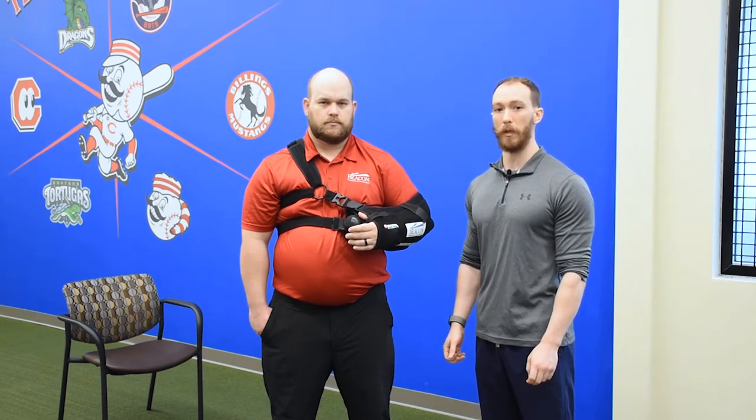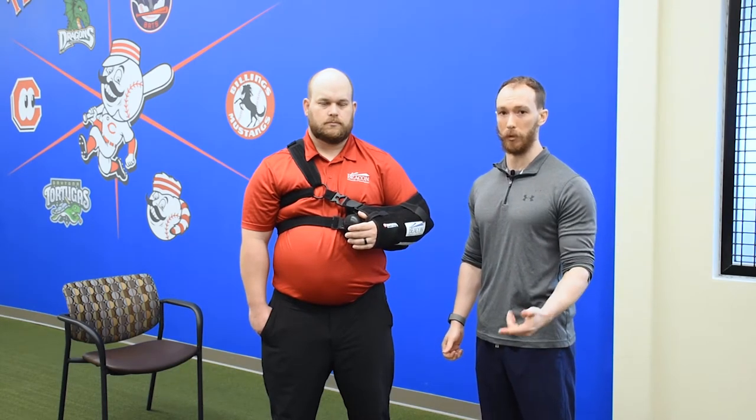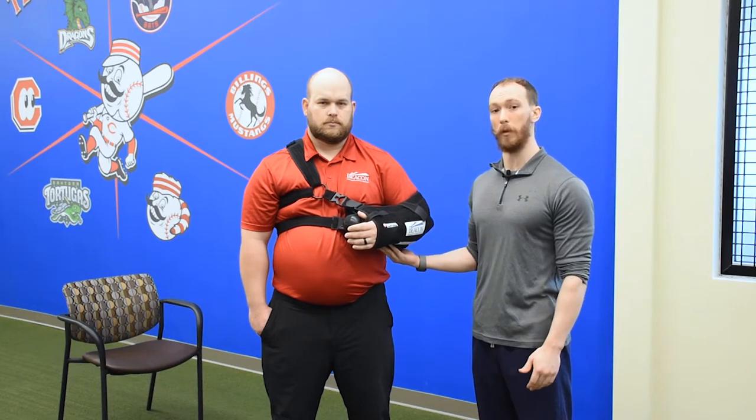Hi, my name's Rob. I'm with Beacon Orthopedics in the DME department. Today we're going to show you how to take off and put on the post-op sling.